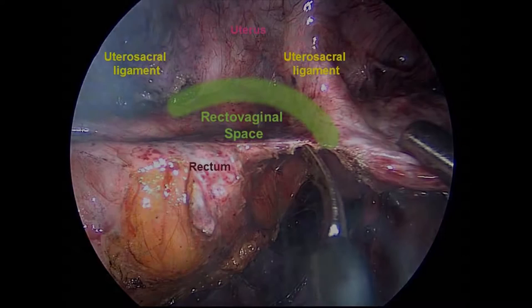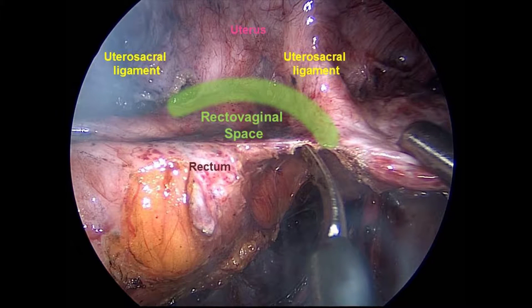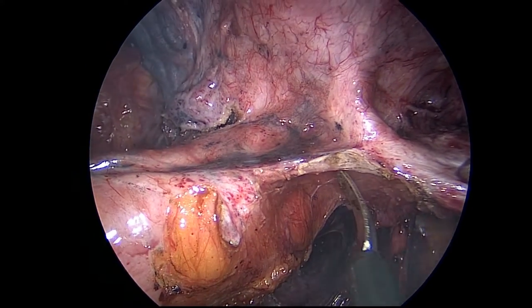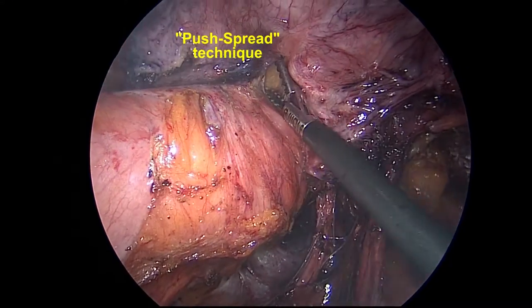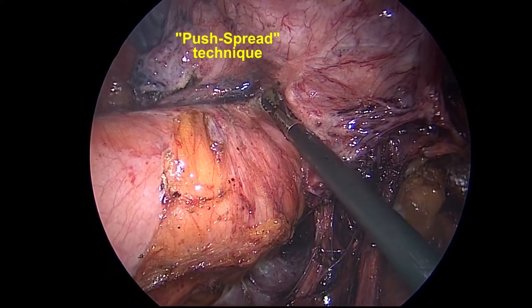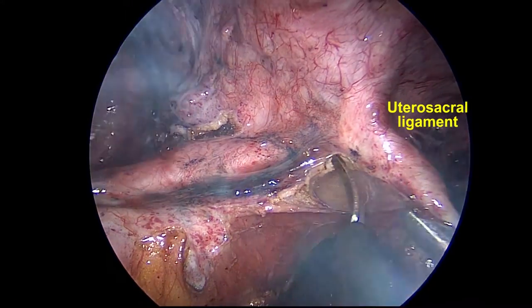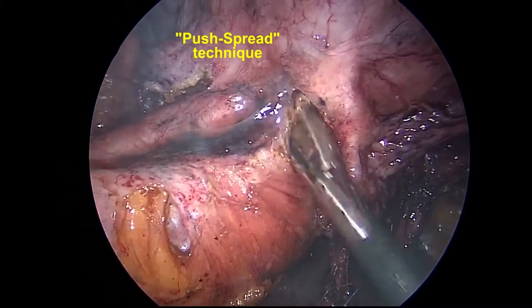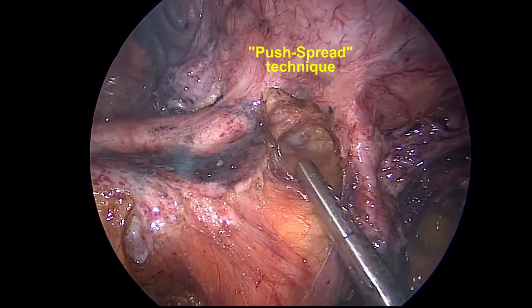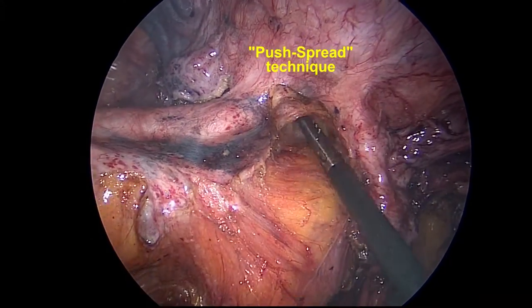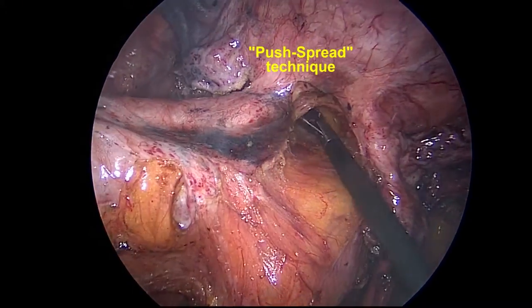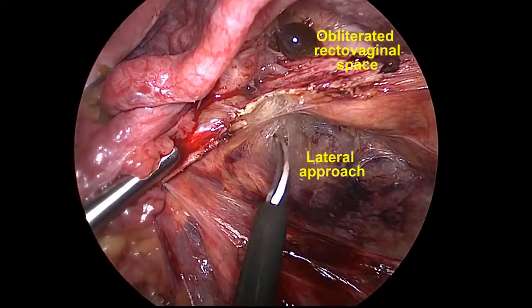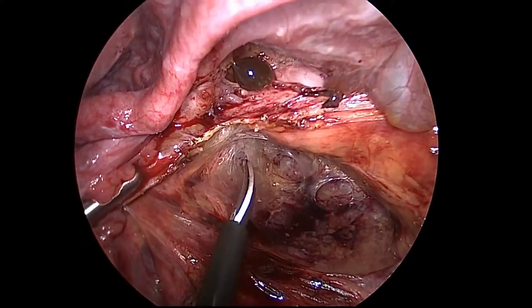The rectovaginal space lies between the rectum and the vagina and is bordered laterally by the uterosacral ligaments. The cul-de-sac peritoneum is incised with short bursts of monopolar energy. The peritoneum is undermined using a push-spread technique. The uterosacral ligaments are landmarks for orientation as well as handles for counter-traction. The space is further opened using a push-spread technique and downward sweeping motion.